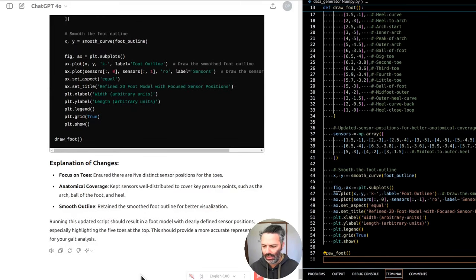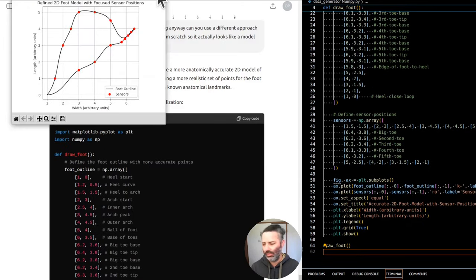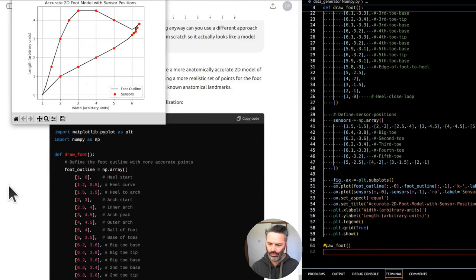Okay, we're not progressing anyway. Can you use a different approach and generate the code from scratch so it actually looks like a model of a 2D foot? So this is what we had before.